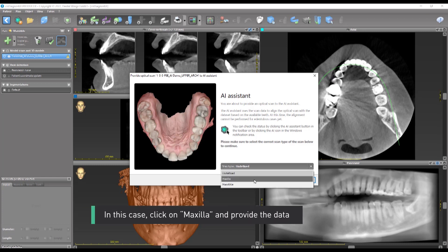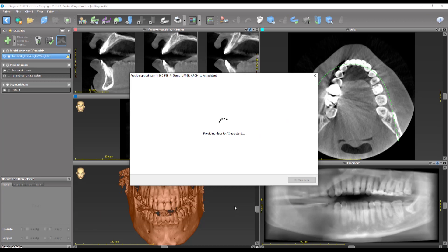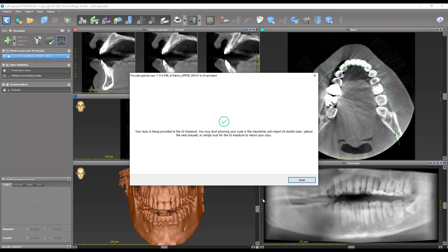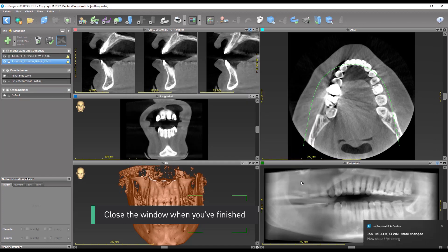In this case, click on Maxilla and provide the data. Close the window when you've finished.